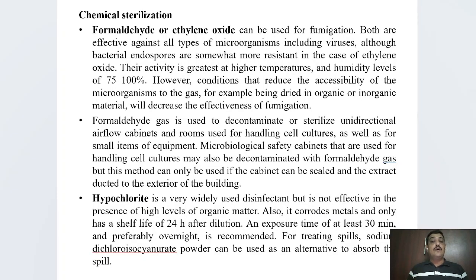And the last method of sterilization is with the help of chemicals, and we call it chemical sterilization. We will be using different types of chemicals. One of the chemicals which is frequently used is formaldehyde or ethylene oxide. Formaldehyde is frequently used for fumigation purposes.